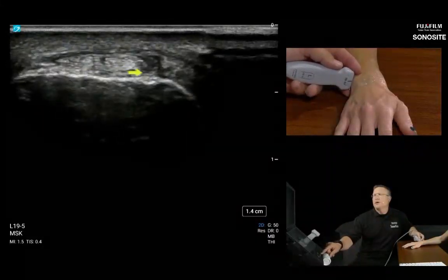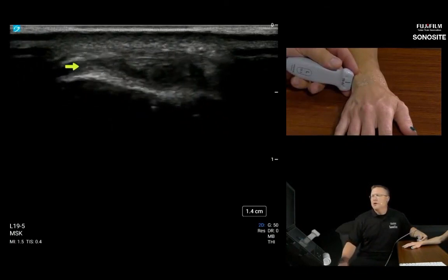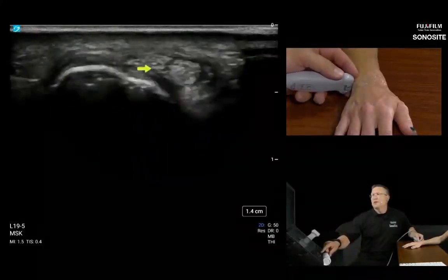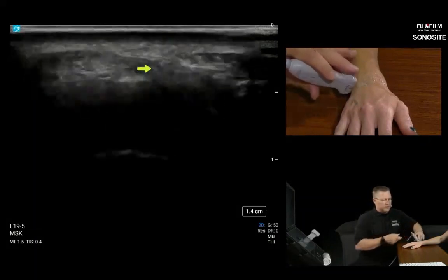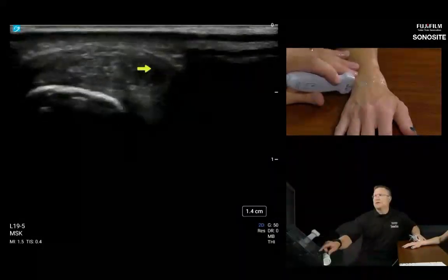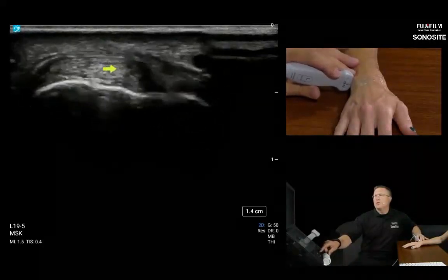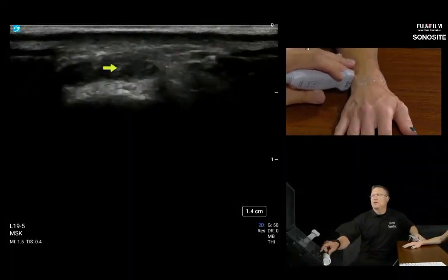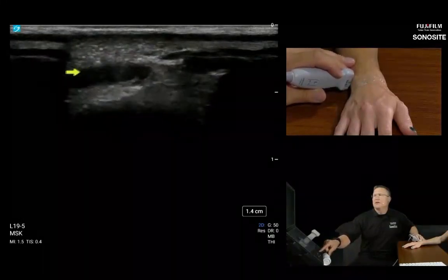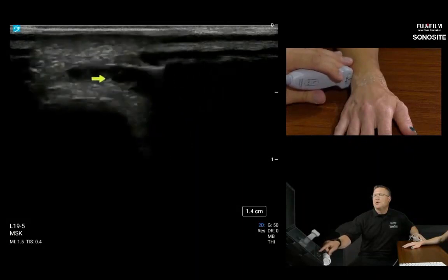But here's ECU. If I want to confirm that, I'm going to tilt the probe down and make the tendon turn dark. Her tendon is very normal and healthy, and sometimes it will just blend in with the surrounding connective tissue depending on the frequency of your transducer. Using anisotropic artifact to your favor really helps you isolate where the tendon begins and where the tendon ends. If it were blending in more, maybe with a lower frequency probe, I would tilt the probe this way and it would isolate just the ECU. And in a healthy tendon, just like all tendons, healthy tendons will turn anisotropic, and diseased tendons will have parts of the tendon that remain echogenic.